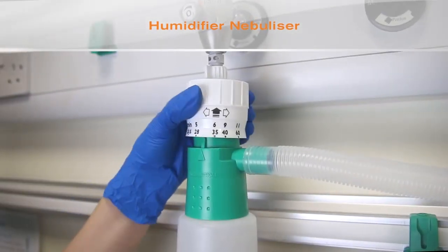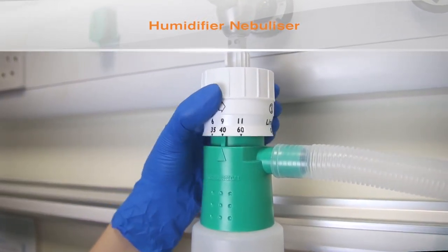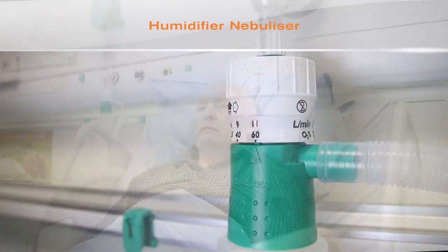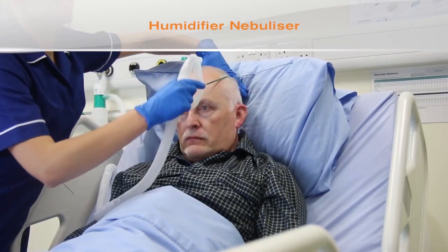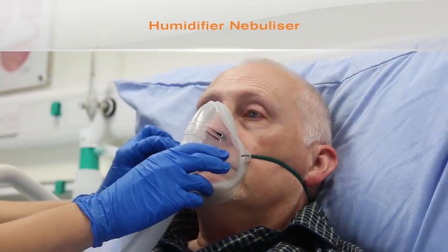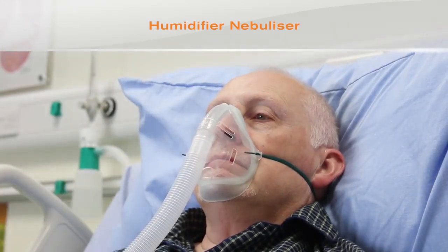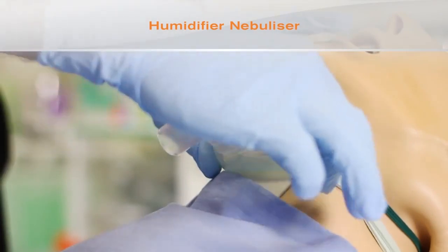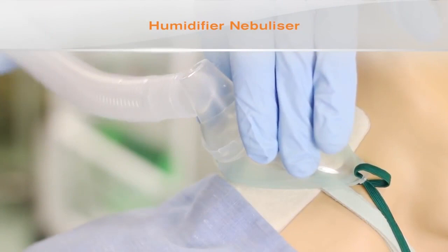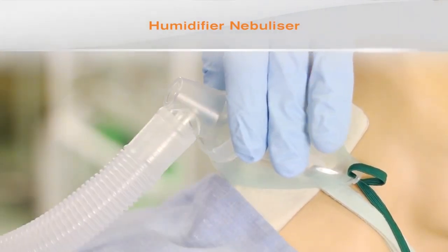The Intersurgical Aquamist makes this simple by indicating the appropriate flow above each oxygen setting. Then fit the delivery device to the patient. An aerosol mask should be placed over the patient's nose and mouth, and the elastic is adjusted to give a secure and comfortable fit. When using a tracheostomy mask, the mask is positioned over the patient's tracheostomy site and secured in place using an adjustable elastic strap around the patient's neck.